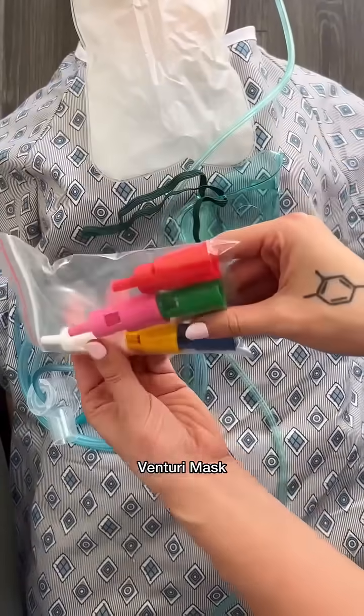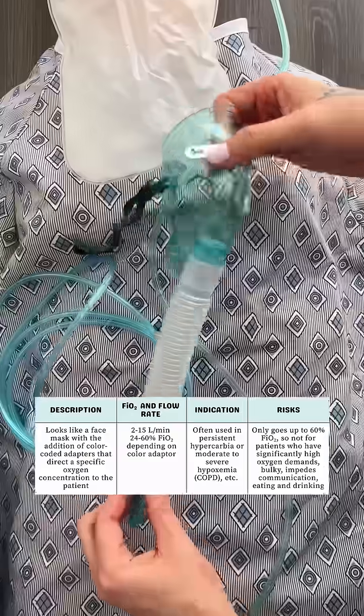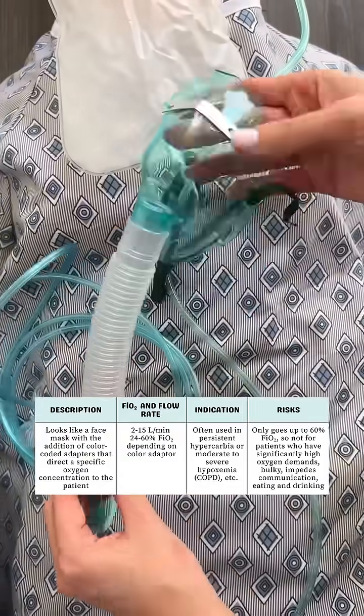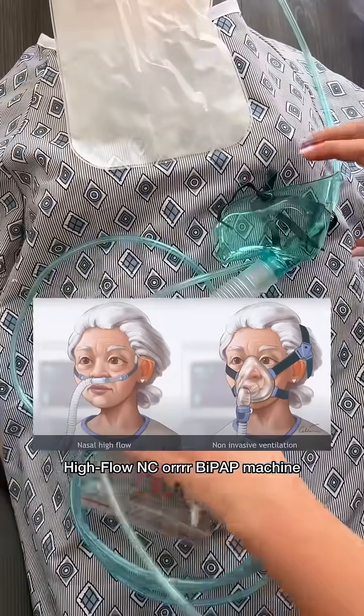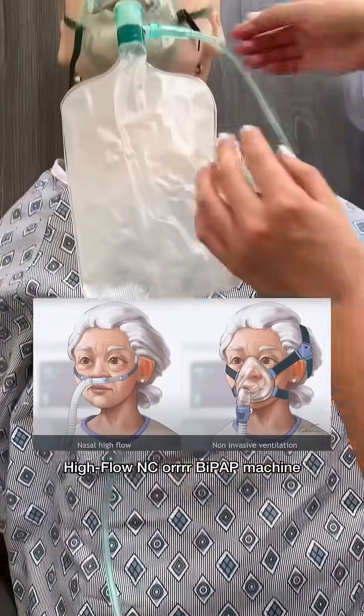We know this is a Venturi mask because of all the color options. This type of mask is the most precise oxygen delivery without the patient being intubated. We would then use a high flow. Obviously, I don't own this, but this is used for DNI patients, pneumonia, severe respiratory distress, etc.